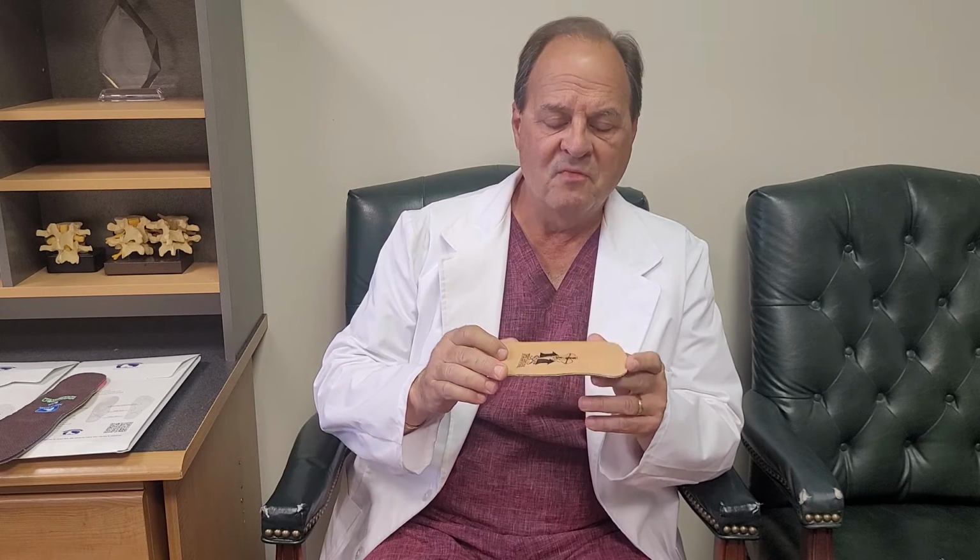They don't look like they're all that profound, but they actually have a very profound effect on the whole way that you stand. So don't be caught off guard because of the simplicity of the orthotic. It has a very, very profound effect on you, and that effect might be a little uncomfortable at first. That's why you have to go through this break-in period. After 2 or 3 days, typically it feels fine, and then you can go for walks and runs and shopping at the mall and all that type of thing without having to worry about it.